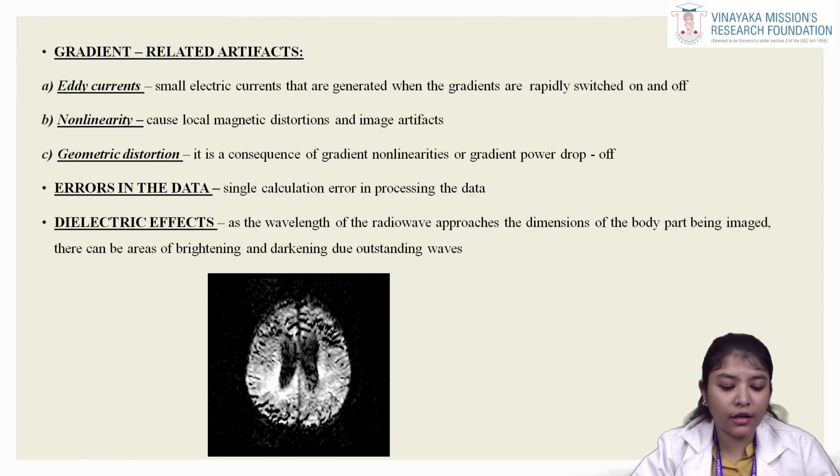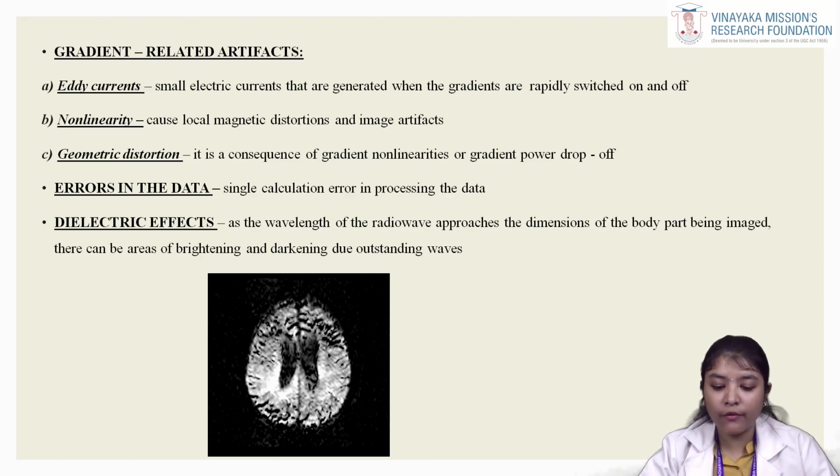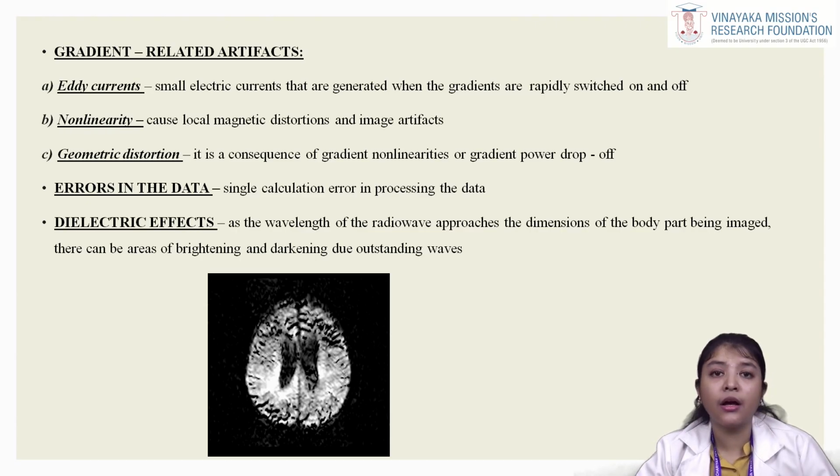And errors in the data are due to errors in processing of data during the signal calculation. And the dielectric effect is nothing but when the wavelength of the radio wave approaches the dimension of the body, then it appears as brightening and darkening due to the standing waves.